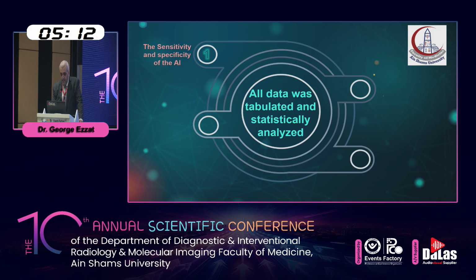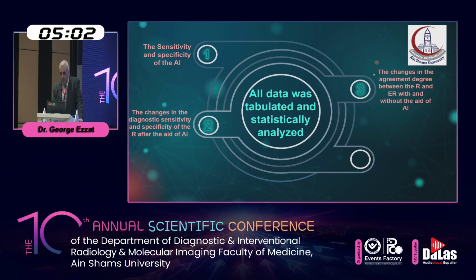All data was tabulated and statistically analyzed. We tested the sensitivity and specificity of the AI, the changes in the diagnostic sensitivity and specificity of the resident after the aid of the AI, the changes in the agreement degree between the resident and the consultant radiologist with and without the AI, and the effect of AI on time consumed for interpretation for both the resident and the consultant.